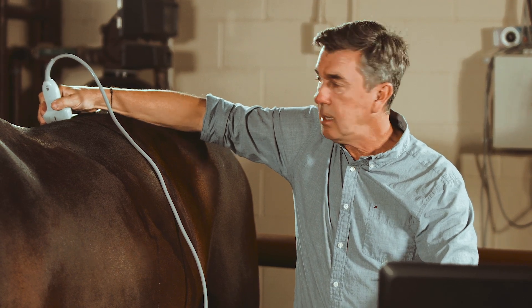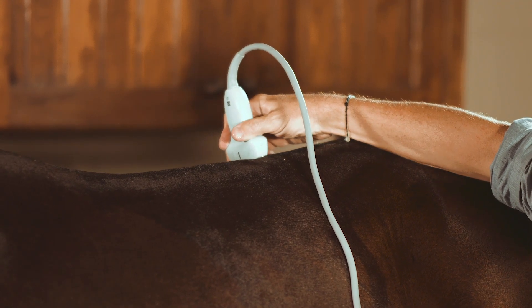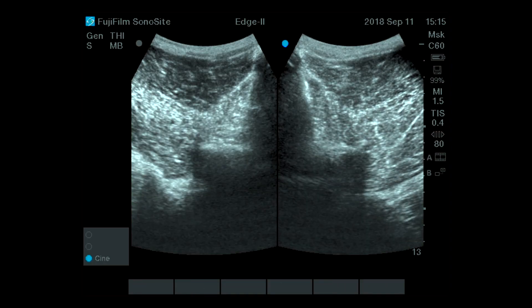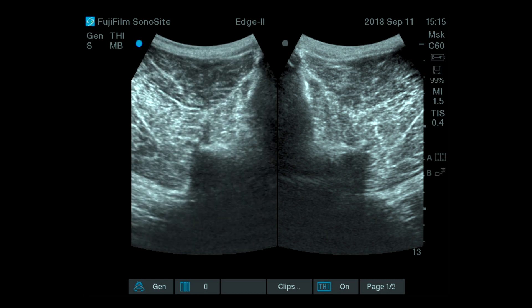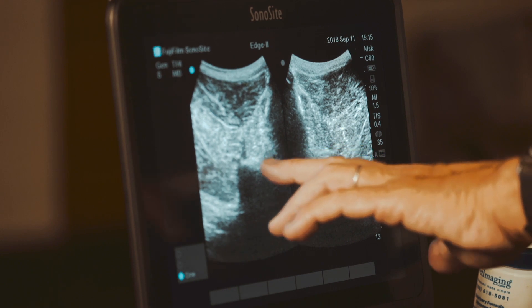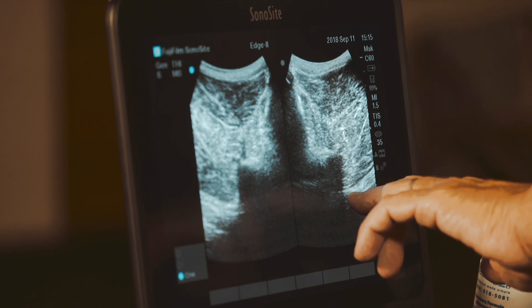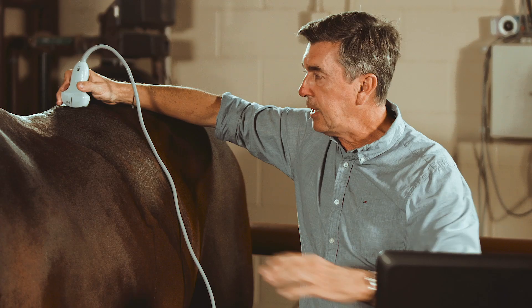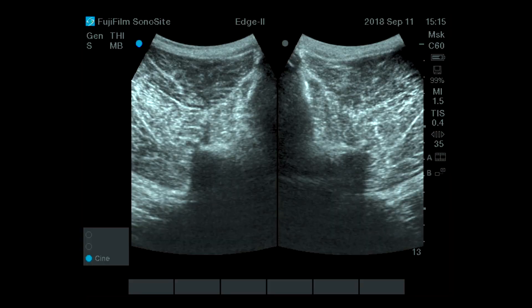Going more caudally, at the stage of T18-L1 or L1-L2, you're going to start to see a more square shape of the vertebra. You can update to see the left side as well, going one by one for each vertebra to see each articular process left and right. The transverse process shows as a very deep line on your screen, and underneath the transverse processes at this level is the psoas muscle.